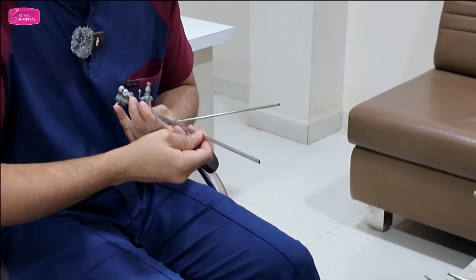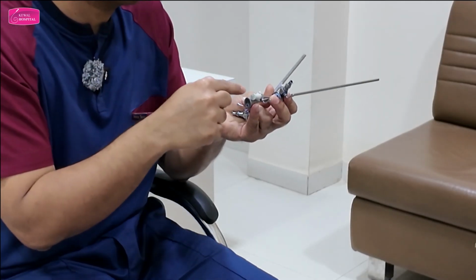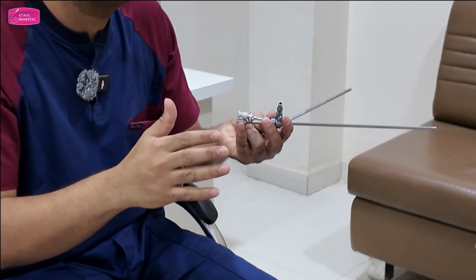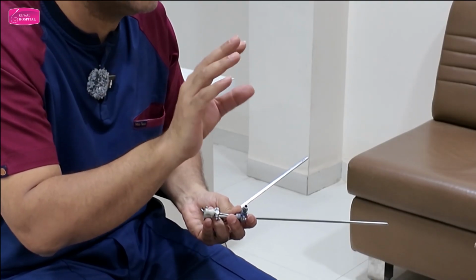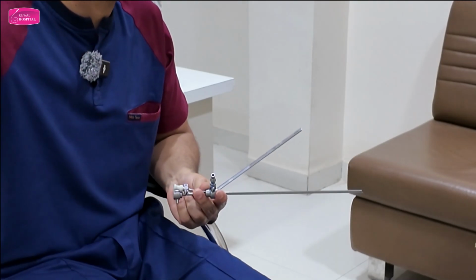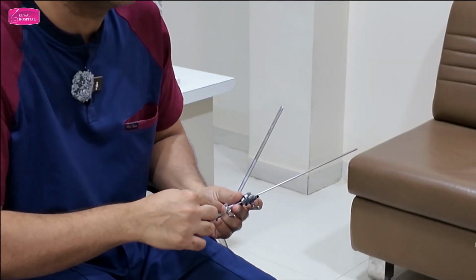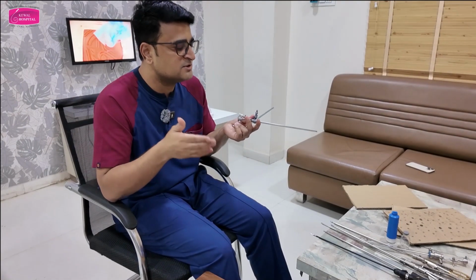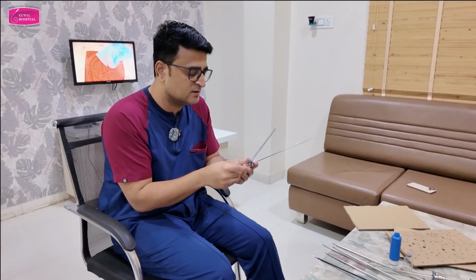So remember, whenever you are doing diagnostic scopy with the operative sheath, the distension is good inside the uterine cavity. But as soon as you introduce the operative instrument, the flow decreases, and then the pressure inside the uterus also decreases because of inflow reduction, and the uterine cavity will reduce in size. Understood? That is why whenever we are introducing the operative instrument, I tell my assistant to increase the pressure a bit more. Understood? Because the upper channel is shared by both. You will notice whenever you are doing diagnostic scopy, there is good distension of the uterine cavity. As soon as you introduce the cannulation wire or some instrument, the uterine cavity deflates. Okay, so remember that.